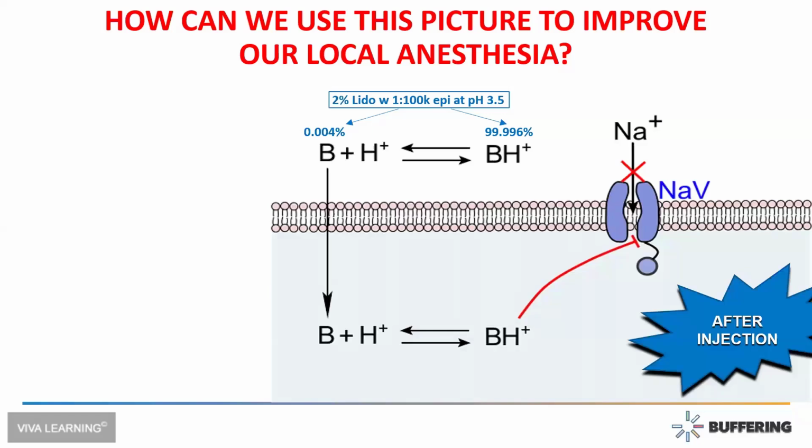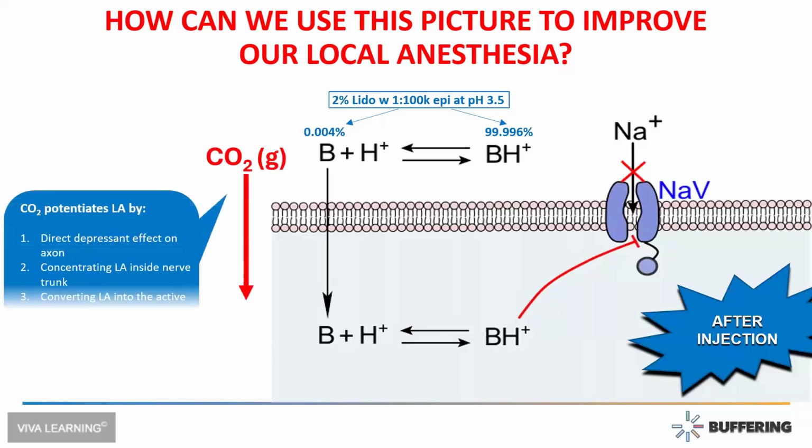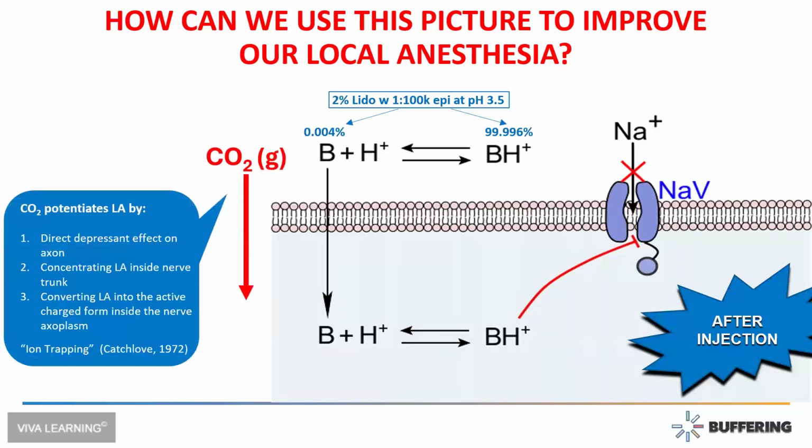Now, one other little thing here to thoroughly confuse everybody is the carbon dioxide gas part of this equation. Now, I mentioned that every reaction involving buffering will generate carbon dioxide gas, which is a good thing. You may see a little bubbling or effervescence in the cartridge, but what carbon dioxide actually does is almost supercharge this reaction.